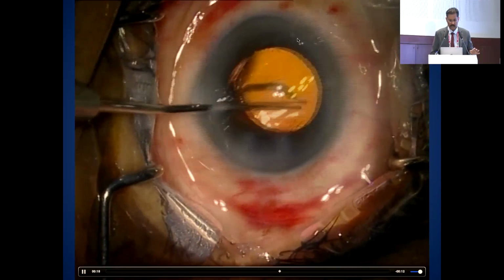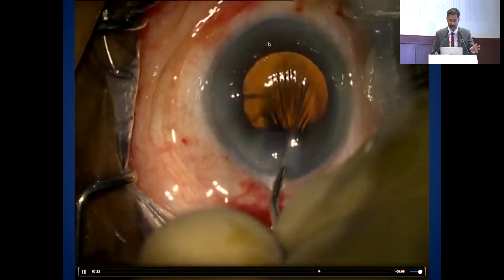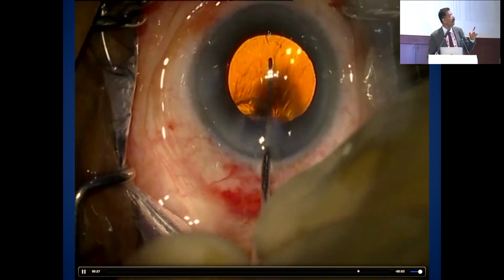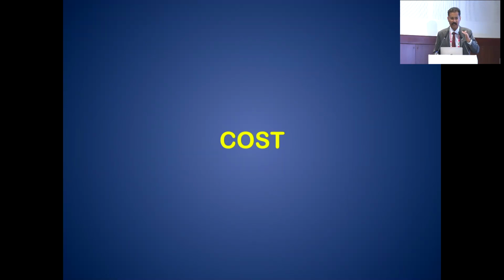Once the lens goes inside, because of the pressure in the bag, the anterior capsule tore. The lens went into the bag, but the anterior capsule tore here. So remember, there may be laser spots adjacent to the cut area, fired to the edges of the capsulotomy margin, and they may be weaker, so be slightly gentle with your femto rhexis.